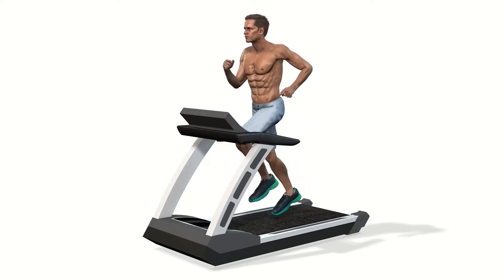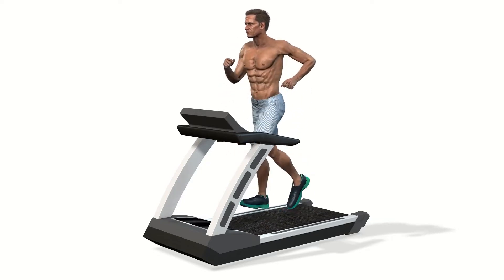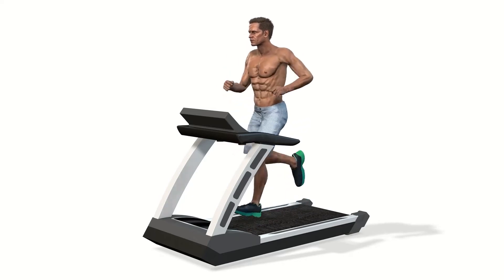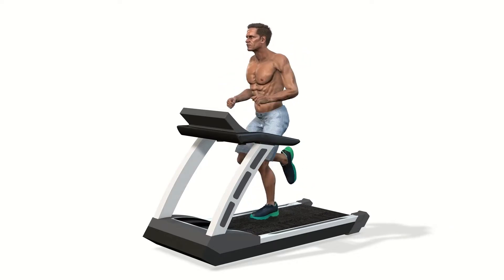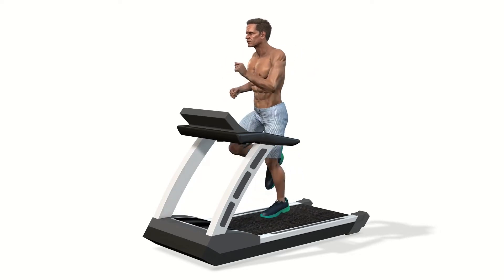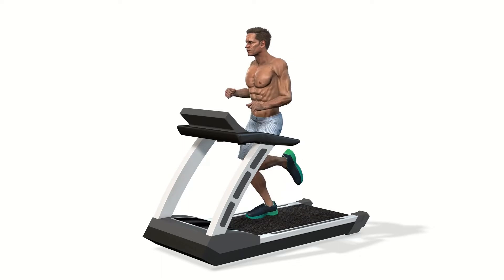Speed and slope of the treadmill platform increase stage wise. The person is asked to walk in a relaxed manner after an initial test run at low speed. Any symptom during the test has to be informed to the attending personnel. Chest pain and breathlessness are important symptoms.